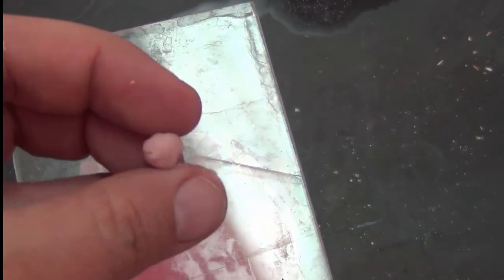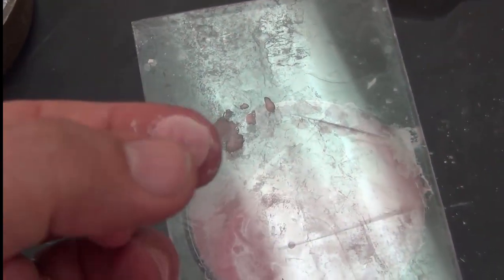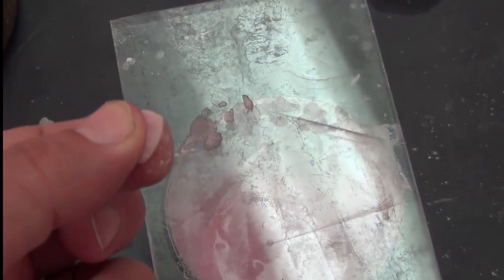Okay, you can see that it's playable and I could press it very well. So now the cohesion is better. It's holding itself in one dough. So we call this the dough stage. If we continue waiting on this, it will go into the rubber stage when it becomes more hard. So let us check our material. The warmth of my hand accelerated the reaction of what I have in between my fingers.